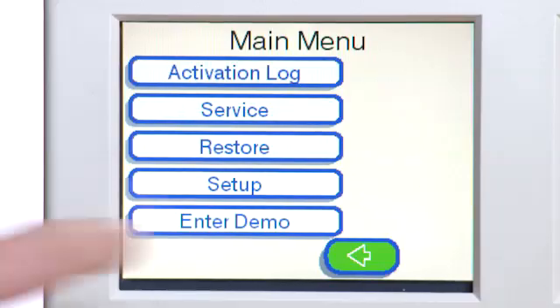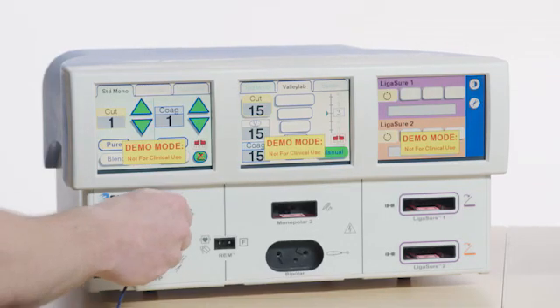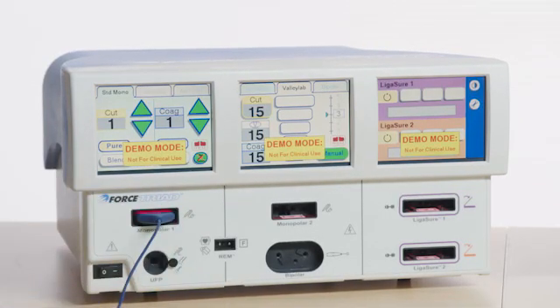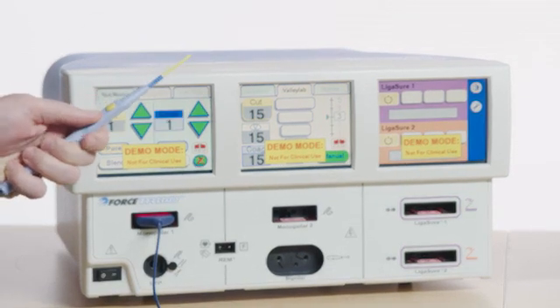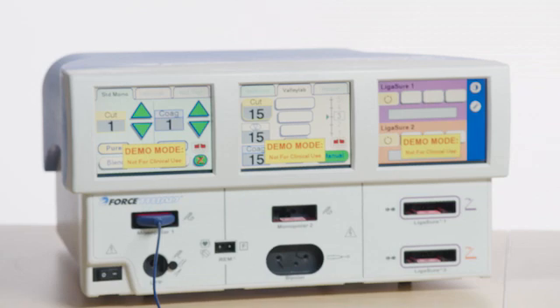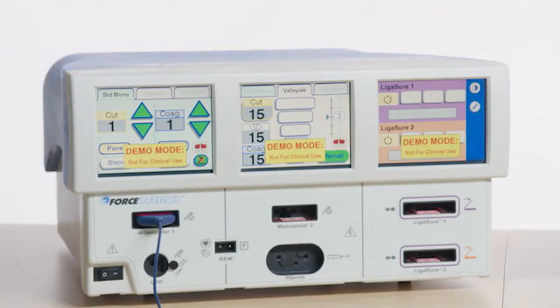In demo mode, activate Mono One Cut from the hand switch. Verify audio is active and distortion free. Rotate the audio knob on the rear of the system through high to low volume ranges and verify the audio remains active and distortion free.